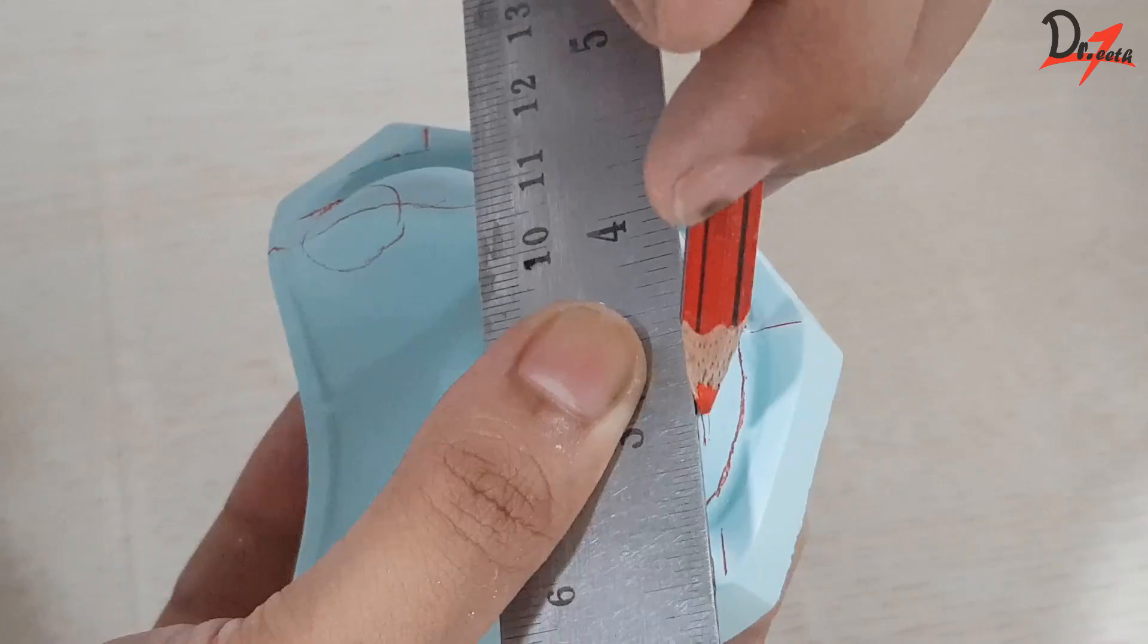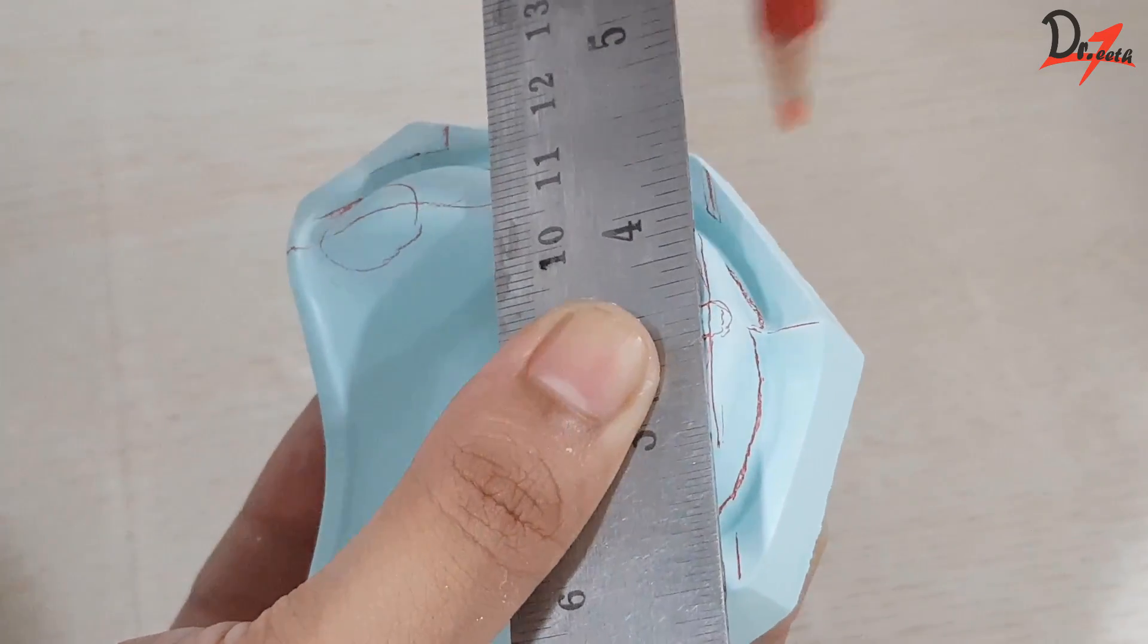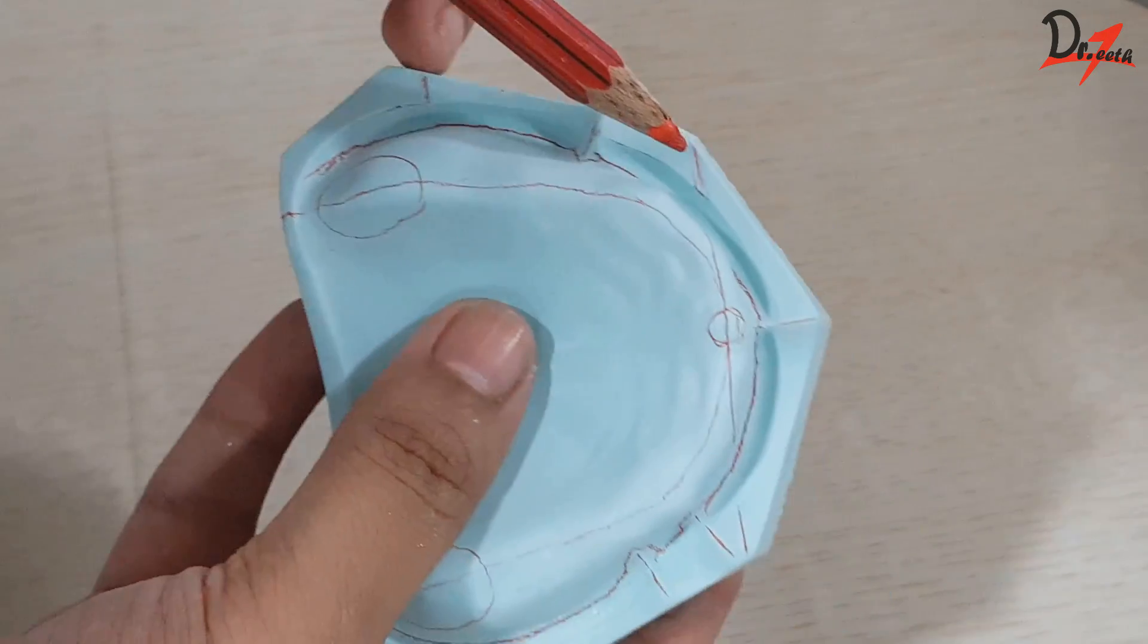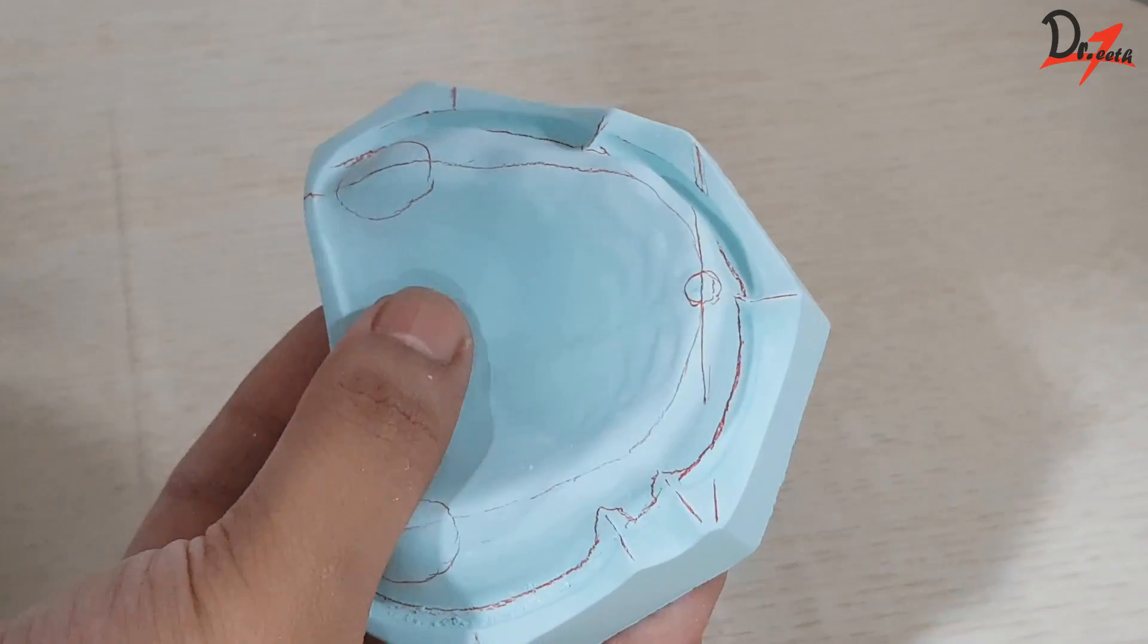But if we draw a line from the posterior part of the incisive papilla and extend it on the land area, that will be the position of the tip of the canine. And we will see this while teeth setting.